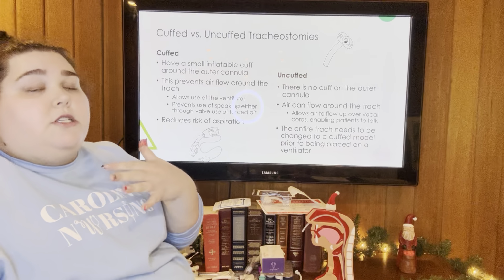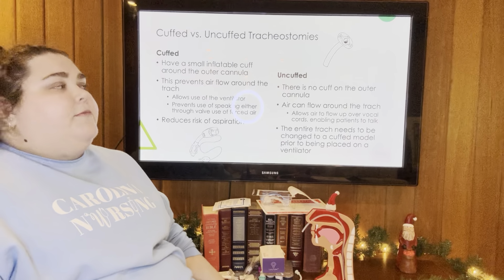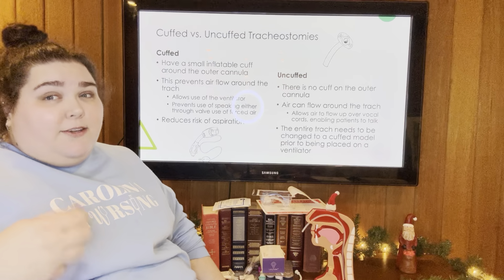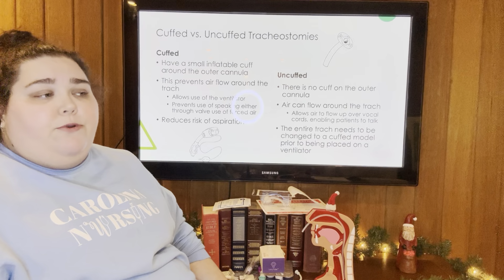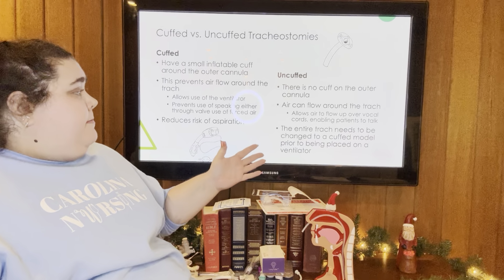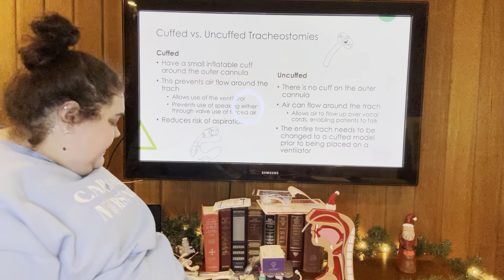Then you have less of a risk of aspiration with the cuffed trach because you're not getting the secretions from your mouth into your lungs. You're not getting any water or anything like that from your mouth into your lungs. Like some people on a chronic ventilator will eat a little bit, that cuff is going to prevent any food or anything from getting into the lungs. So that's kind of the difference between cuffed and uncuffed trachs.